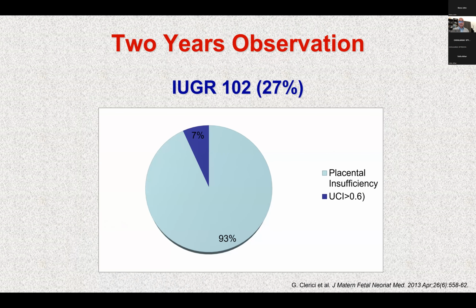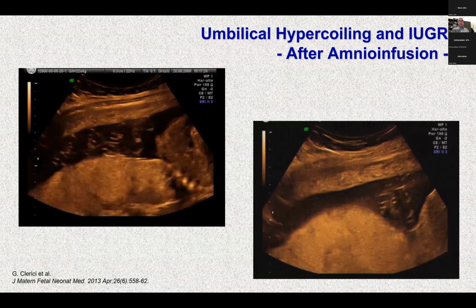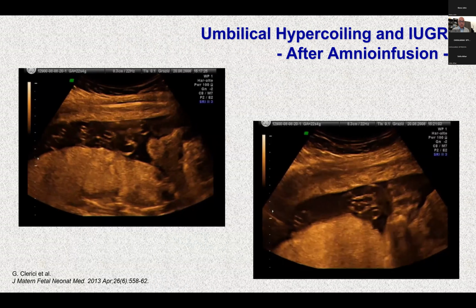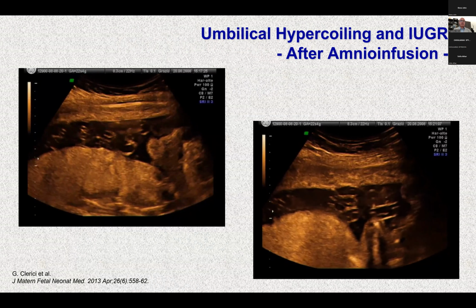And we show you the result of this study, in which we find some cases, almost 7% of cases with very atypical IUGR with the situation that I'm going to show you, with the atypical hemodynamic pattern.